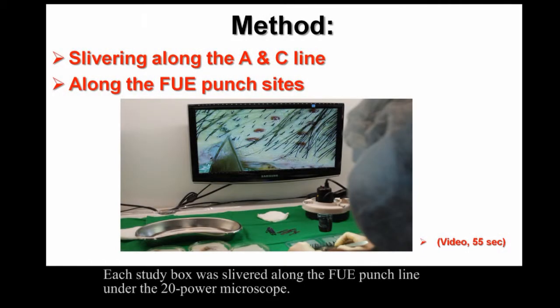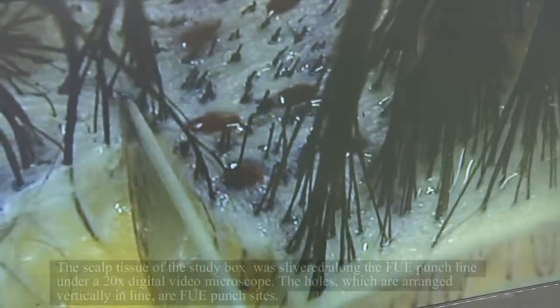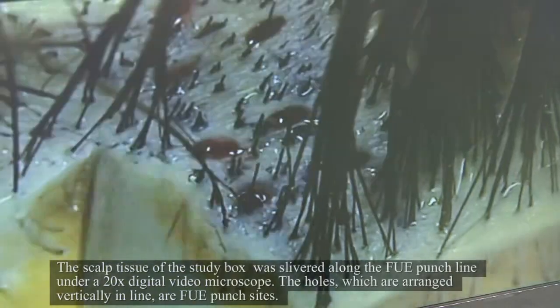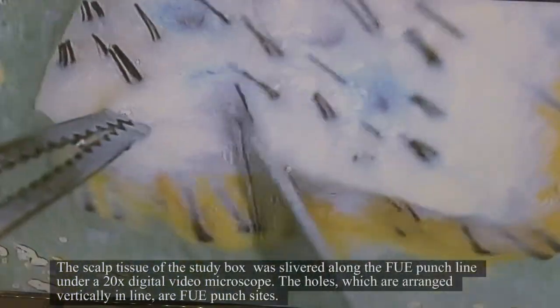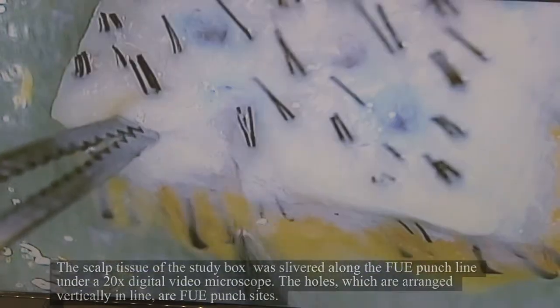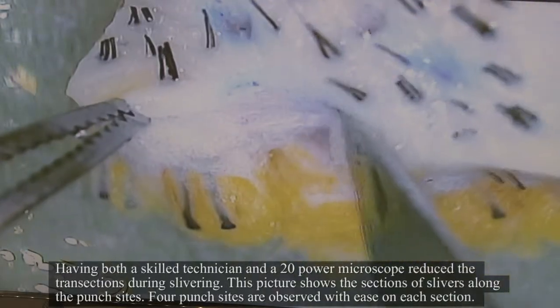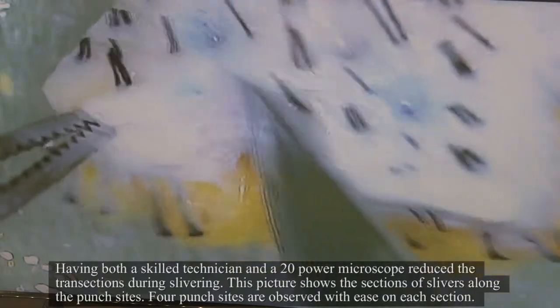Each study box was slivered along the FUE punch line under the 20-power microscope. The scalp tissue of the study box was slivered along the FUE punch line under a 20-power microscope. The holes, which are arranged vertically in line, are FUE punch sites. Having both a skilled technician and a 20-power microscope reduced the transections during slivering.